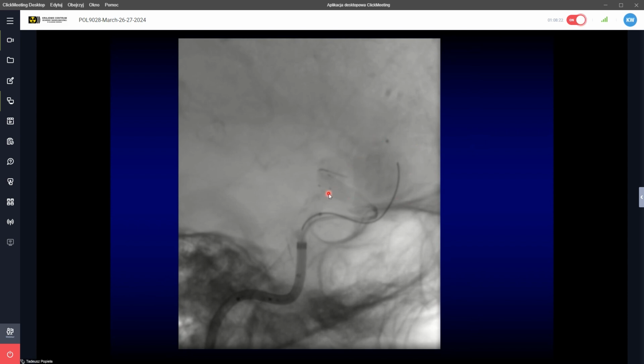And on this catheter here, there is the beginning of the stent. There are 3 markers. There's a distal part of the stent which is already opening, and this is the delivery microcatheter. The brain stents, all of them, are self-expandable stents. It means that when the stent is delivered in place by the microcatheter, we can pull the microcatheter back, and the stent is going to open by itself. So again, one microcatheter is inside the aneurysm sac. The second one we are using to open the stent, which will cover the aneurysm neck.